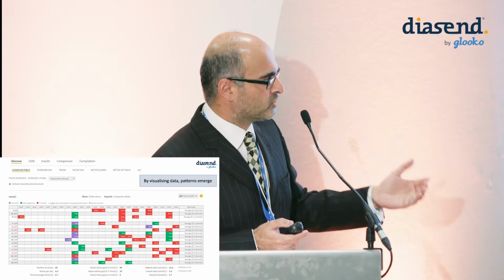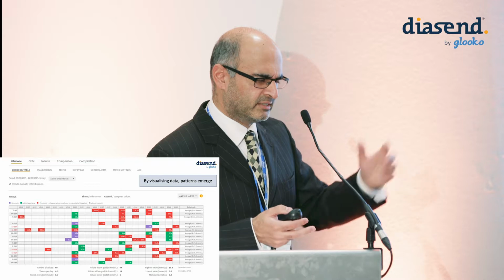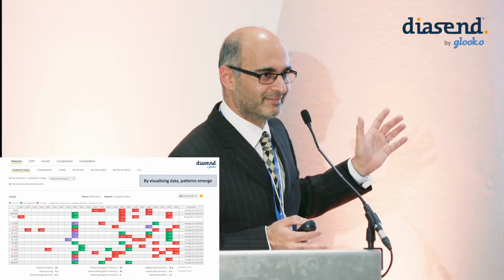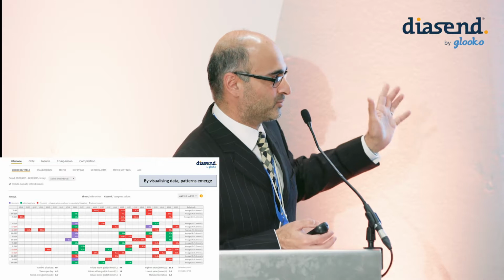In addition, the patient can come to an insulin pump clinic, bring their pump with them or their meter. It can be connected to the box and you can look at their sugar levels over time. So Big Brother or Sister is truly watching. There's not really any hiding place here. There's no ink or faking of numbers with this. It is what it is. It's digital, it's captured. You can't tweak it or edit it afterwards.